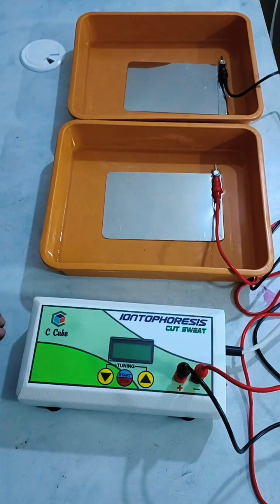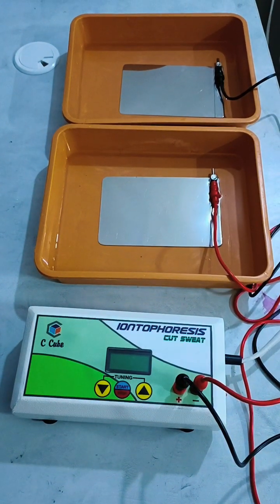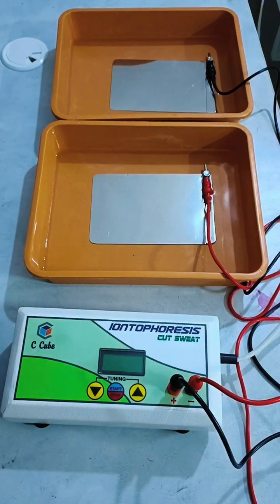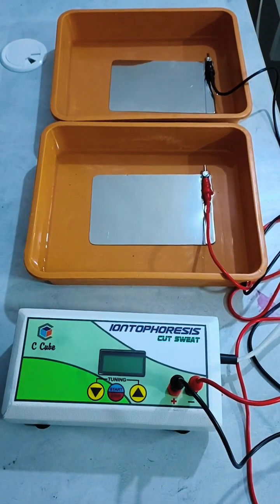This is a hyperhidrosis device used for the treatment of hyperhidrosis, or over-sweating. The brand name is Cut Sweat, manufactured by CQBadvance Technologies, Bangalore.